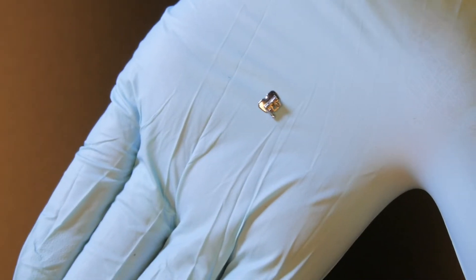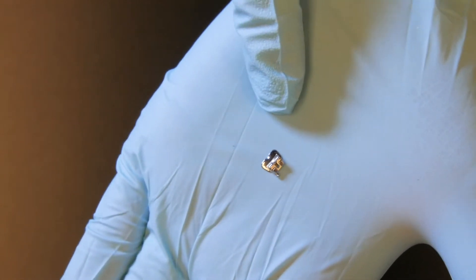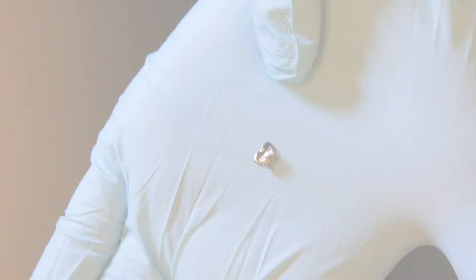We also offer Lotus Plus DS self-ligating buccal tubes. This is one of the world's first buccal tubes with a thermal NiTi clip. You can decrease wire change time and the use of step bends by using a complete self-ligating system.